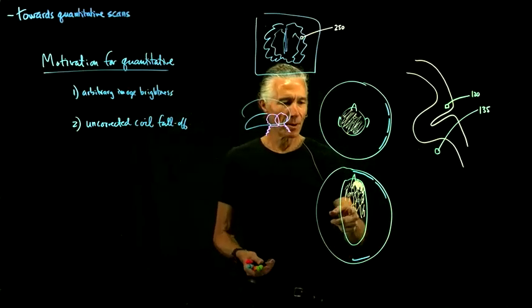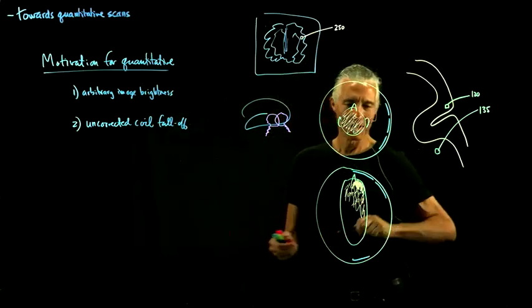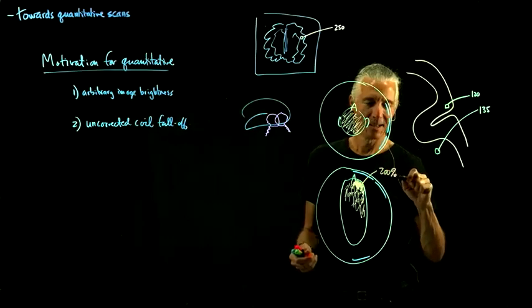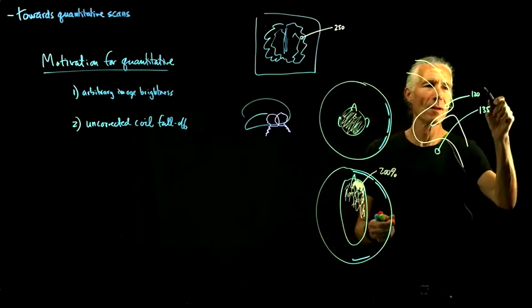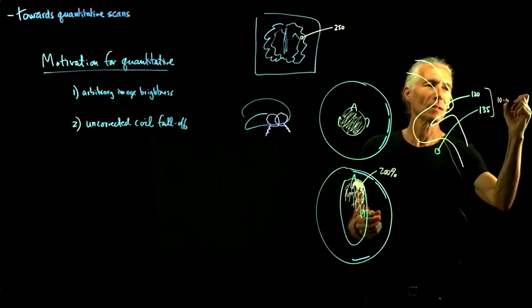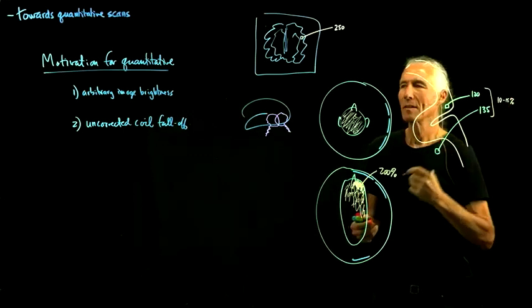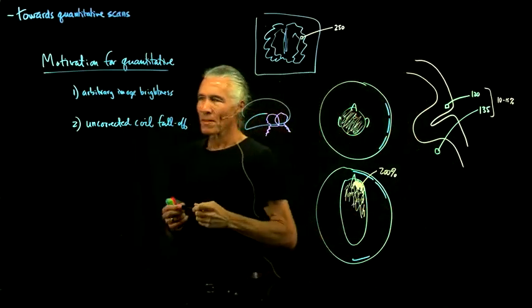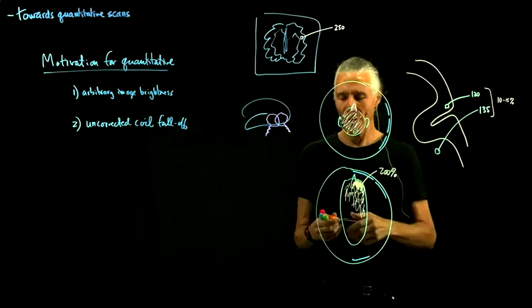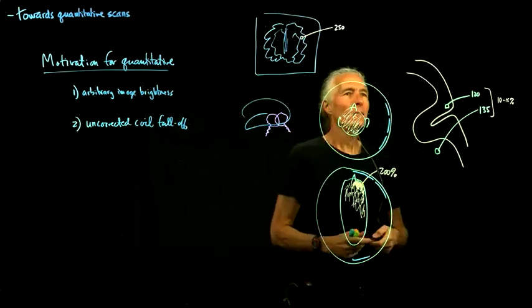So compare that to this 200% brighter. So the gray matter and white matter might be 10-15% on a good day, depending on your pulse sequence. That's a reasonable amount of difference in order to distinguish gray and white matter. But what about different areas?